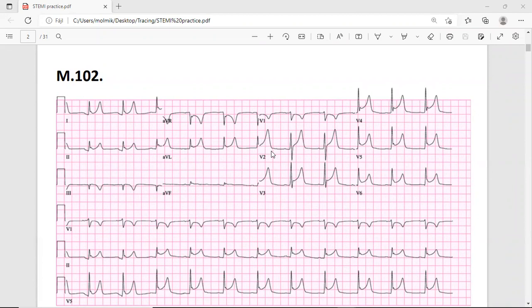Just one question. How do you distinguish between something that's not pathological and something that is pathological? Depending on the patient; we have to look at the patient as well. Without a patient, it's difficult to diagnose anything based only on the ECG. This is why it's together. That's an evaluation that needs a patient. You are not curing the lab results, you are curing the patient. So you have to get a correlation.